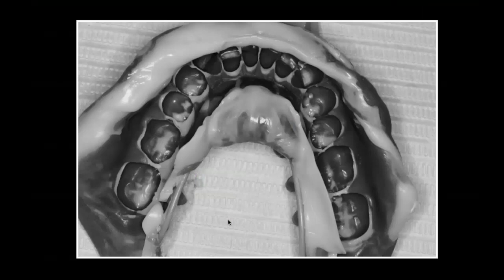So this is what it looks like. What I did was I took the color out. The dark color is actually the putty. The light color is the wash. So it's pretty cool to see it like this in what you're going to pick up. So the putty actually gives a pretty accurate impression, but you don't have to worry about, again, the saliva and the tongue, and it gives a really accurate impression. And again, the reason I like the Silginat on top is because it flows, it gets the palate and everything.